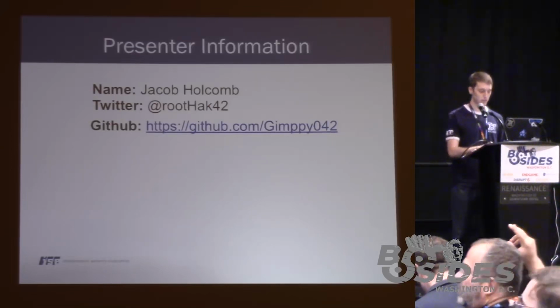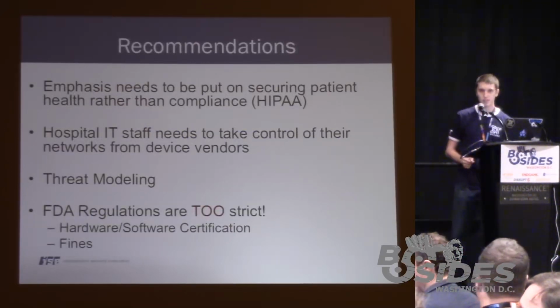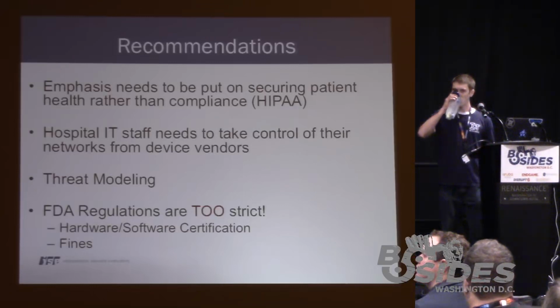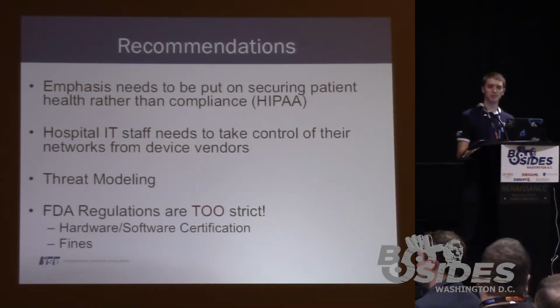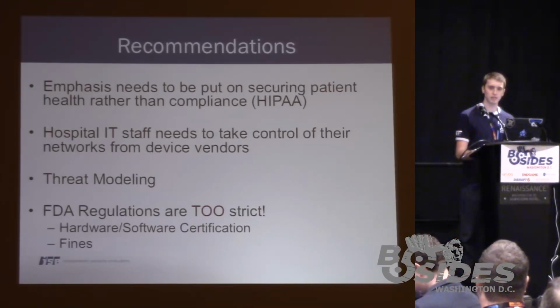Can you go back one slide, please? I was talking to somebody at DEF CON who says she's with the FDA, who says that the bottom bullet is actually a misconception that's not actually true. Maybe it was at one time. Ultimately, can we source that if you put a patch or a software update or a firmware update, then you really trash the whole certification of the device?